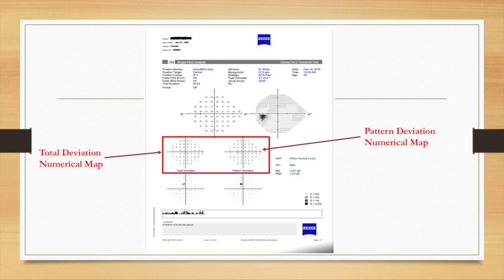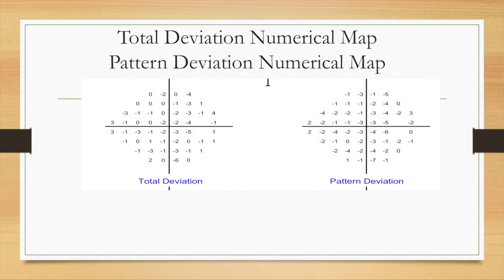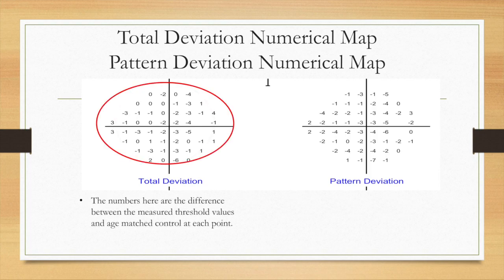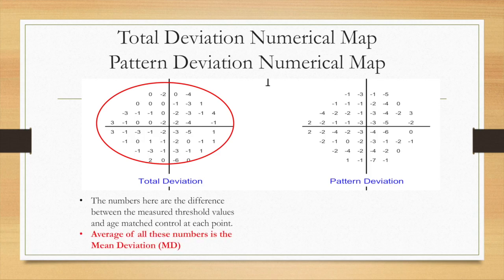Now the total deviation numerical map and pattern deviation numerical map. On the left you can see the total deviation numbers, and to the right you can see the pattern deviations. Total deviation is the decibel deviation of the measured threshold value — presented in the sensitivity numerical map — from the age-matched control at each point. The average of all these numbers on the total deviation map is the mean deviation. I will talk in more detail about the mean deviation later on.